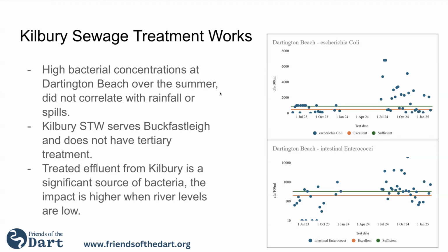So we were wondering if Kilbury Sewage Treatment Works was responsible for the levels of pollution we were seeing. We investigated this by testing above and below the sewage treatment works, which alarmingly revealed quite high levels of bacteria coming out of the treated effluent.